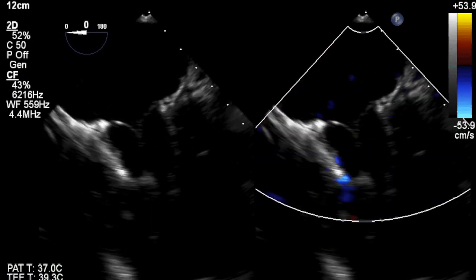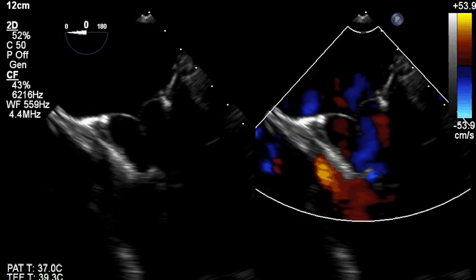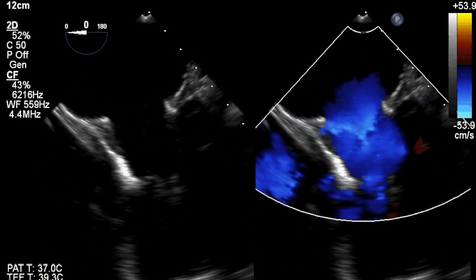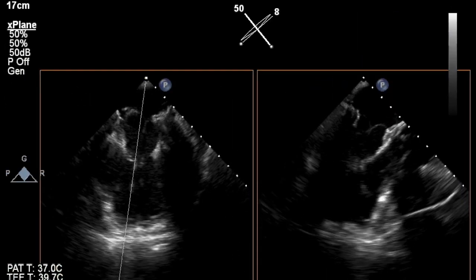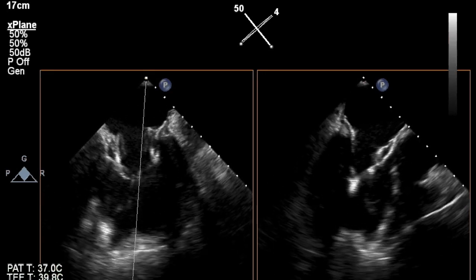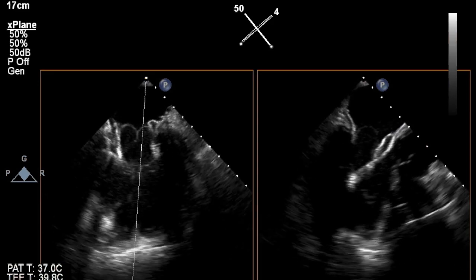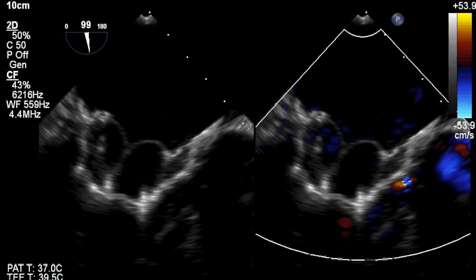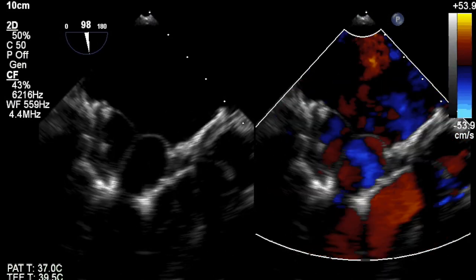Tether tension is checked hemodynamically and visually echocardiographically. A pigtail catheter is usually used to evaluate the LVOT gradients and measure LVEDP, and the amount of tension to the LV apex is measured via a device. You can visualize the apical indentation due to the tension. This is to assure the valve does not change its position and lead to paravalvular leak.